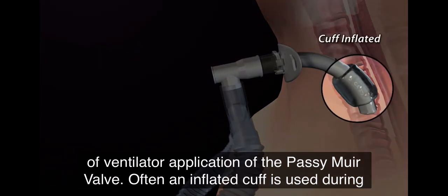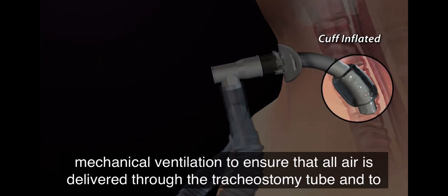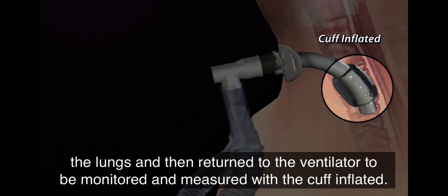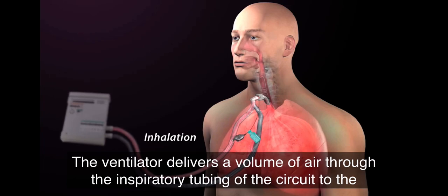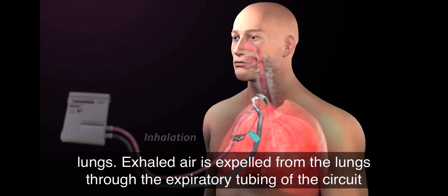Often an inflated cuff is used during mechanical ventilation to ensure that all air is delivered through the tracheostomy tube and to the lungs and then returned to the ventilator to be monitored and measured. With the cuff inflated, the ventilator delivers a volume of air through the inspiratory tubing of the circuit to the lungs.